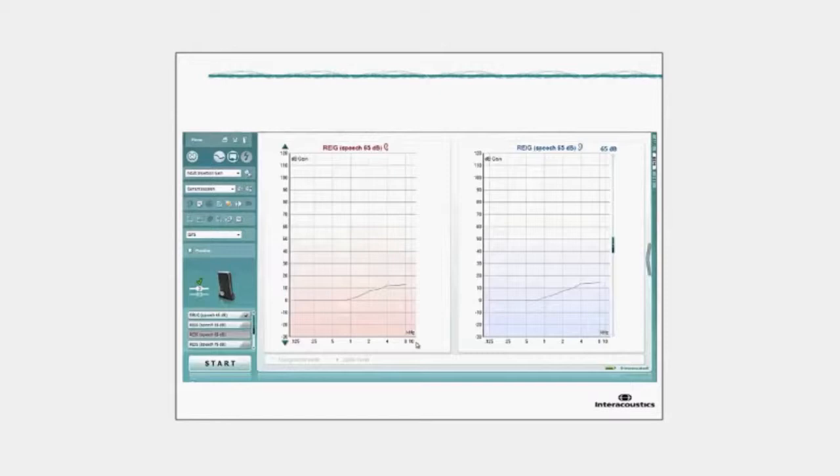So again, in the next screen, I've created a nice video. And what you will see here is the binaural measurement being run. And once we have a target curve and we let it run for a little bit, I will click onto the intensity slider, which will flicker the measurement and reset the average. There we go. So let's say if there was a disruption or somebody spoke or the patient moved, then without stopping and restarting the measurement, we could quickly reset the average and continue what we're doing rather than having to add time by restarting the measurement again.